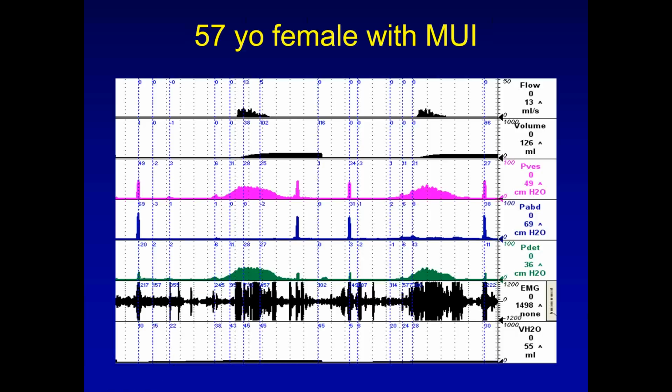Be cautious when you hear someone say, my first sensation is 22. Your patient says that, ask her or him, are you sure it's a true sensation or are you just feeling a cold sensation? Because cold could be the temperature change from the cold fluid you're instilling, if you didn't warm it up. Cold or temperature is not a true bladder sensation. But in her case, 22 was her true bladder sensation.